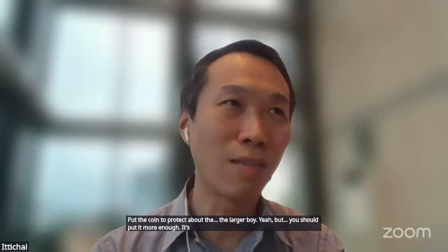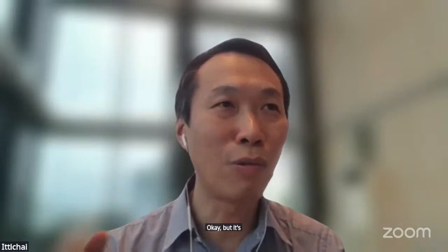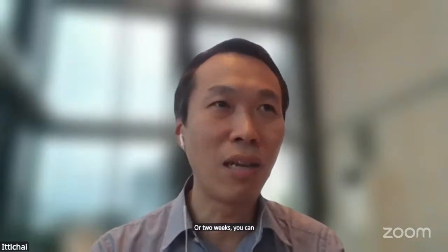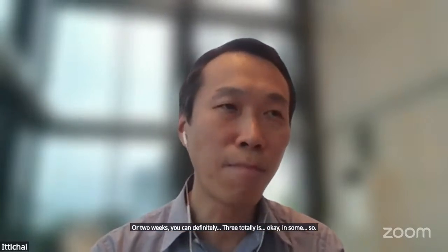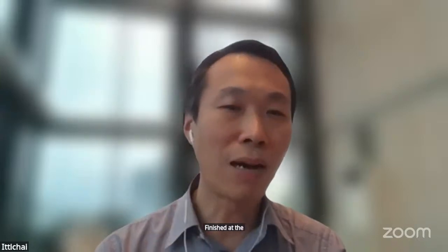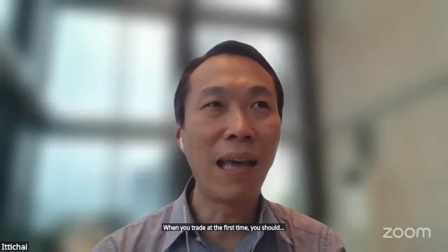It's not loose, just tight, but you can have some residual aneurysm. It's okay, but not too much. Then you bring the patient again, maybe one week or 2 weeks. You can definitely treat totally. It's okay in some situations, but in some blister cases, blister aneurysm, you should finish at one time, because it's a very high risk for re-rupture. When you treat at the first time, you should definitely do it in only one time.